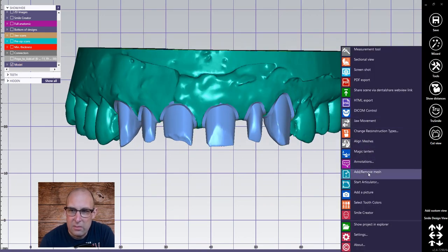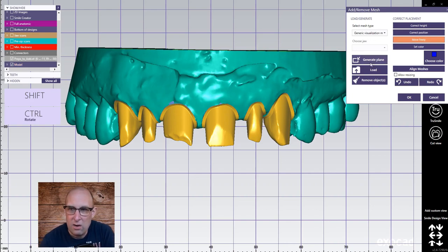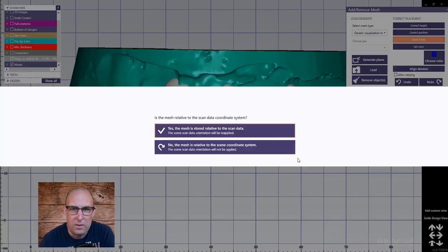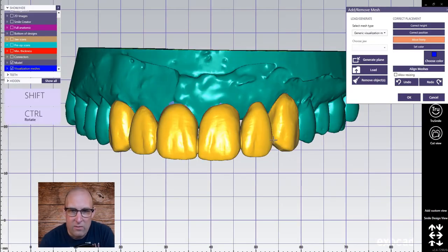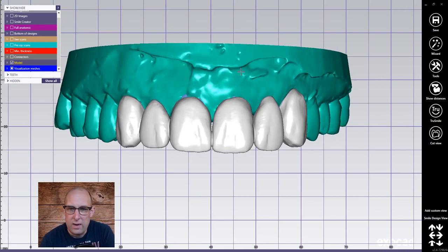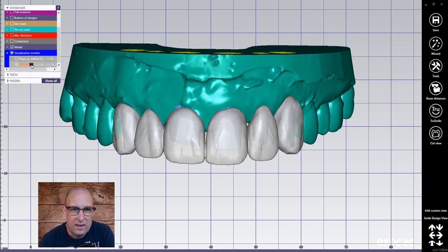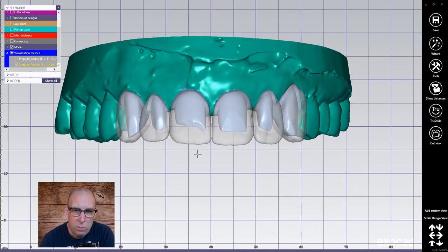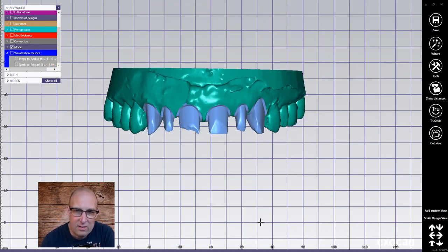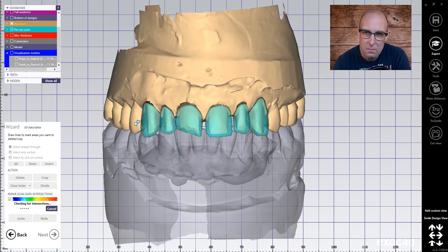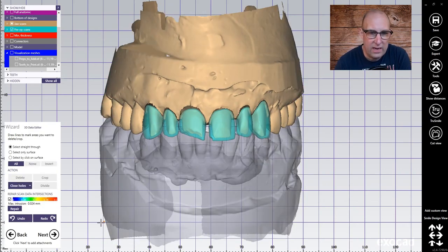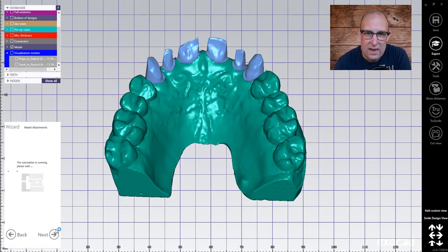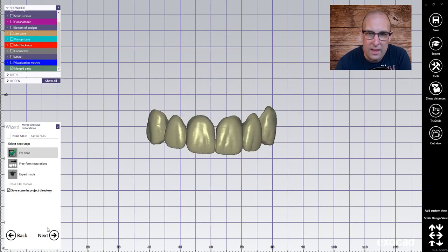Just for demonstration, I'm going to import another mesh here — I'm going to load the teeth that I want to print later on, so you can see that they fit perfectly in there. Make them a little bit visible, and here they are. I have a prep model with removable dies and a diagnostic wax-up at the same time. I go into wizard mode again and I'm going to finish the whole thing — fix, cut it, yes. There you go.